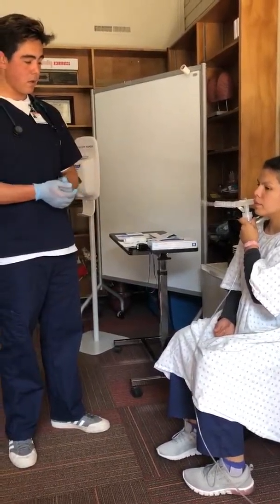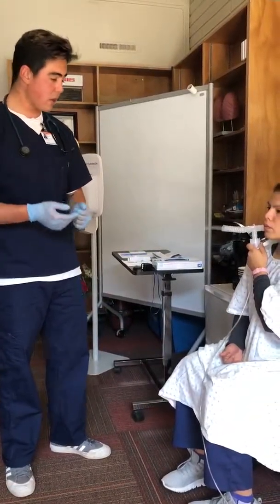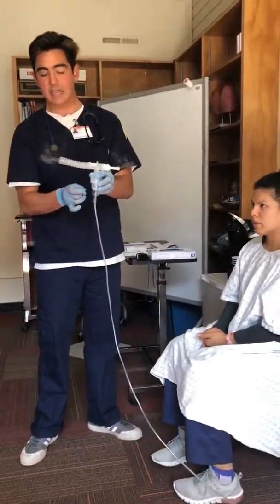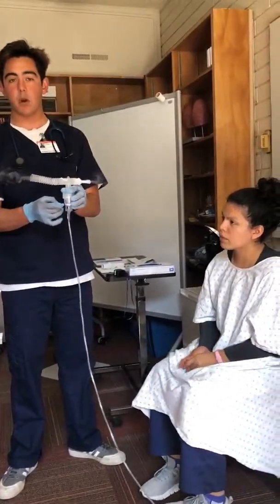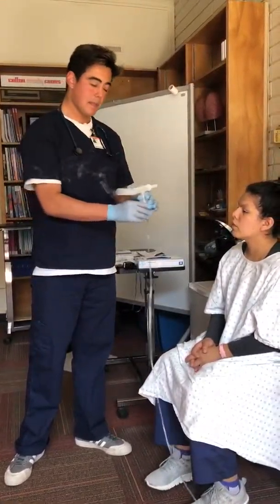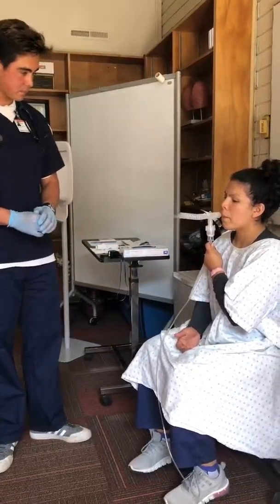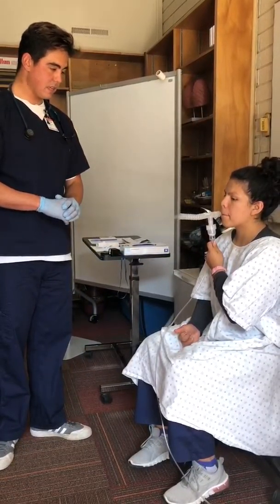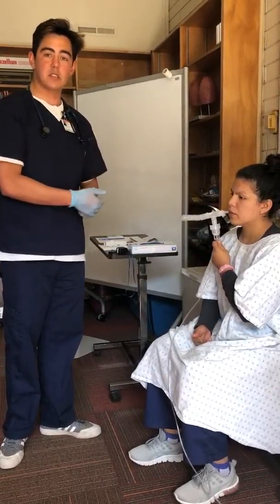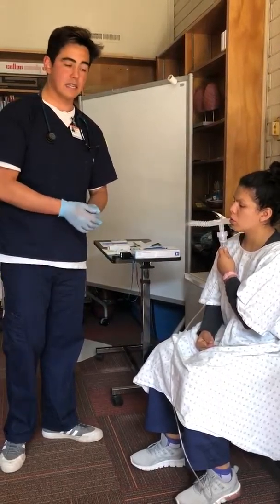So after this, the treatment's going to take a little while, but as it starts to run out, it'll begin to sputter. We're going to want to take the SVN from the patient and flick it to get any of those condensation particles to fall back to the bottom to be re-nebulized. So we're going to flick it, get them to drop back down, the patient can resume the treatment. So we're going to be doing this for a little while. After we know we're done when the medication is no longer aerosolizing, we flicked it and it's not continuing anymore.